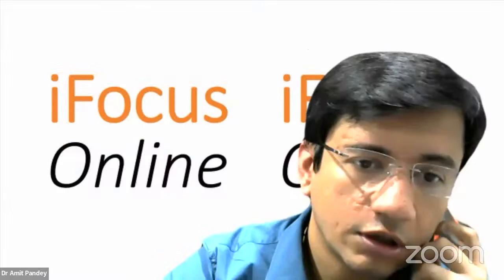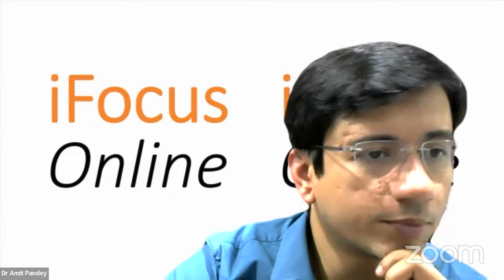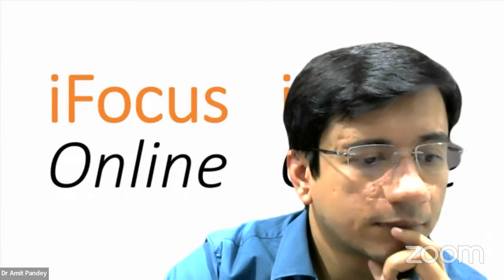One question is on SICS in poorly dilating pupils, sir. Subodh sir, if you can. Actually, what I normally do is use the VR scissors to make micro sphincterotomies, because those scissors are very excellent for making sphincterotomies.